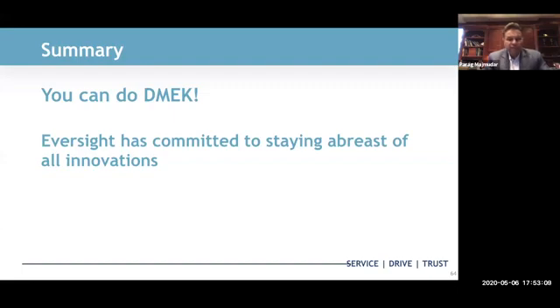And that kind of segues into another area that I want to talk about. I think the next question is what's the protocol for supine positioning after DMEK? So I've always done an inferior iridectomy and a fairly full air bubble. And I thought that rather than having them stay in the clinic or in the OR, when I went to see Melles in 2013, they did all theirs under general, and the patient had the procedure done. Took them about 45 minutes, an hour to do the procedure because they were super meticulous, as I said, about getting every single piece of Descemet's out, 9.5 millimeter graft. And the patient sat there under general anesthesia for an extra hour after that.